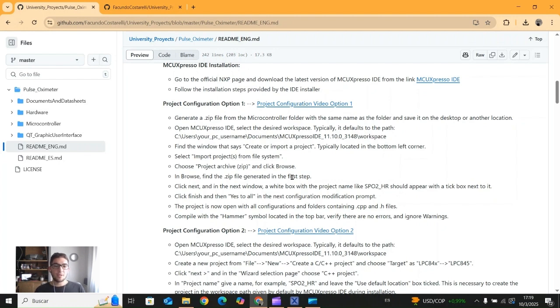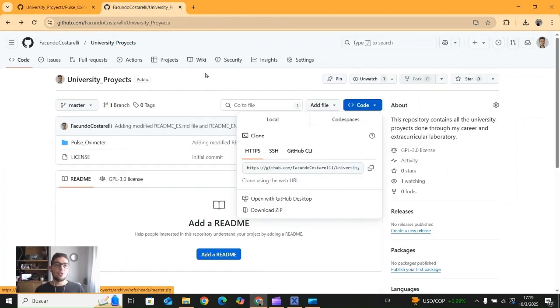So the first thing is going to be to download the entire repository, because we need the microcontroller file. In this case, we are going to use my project as an example. However, you can use any project that you want. So we go to the University Projects repository. We just need this one, but the easiest way to download any folder or anything from GitHub is just to download the entire repository and then just delete the projects that you don't want.